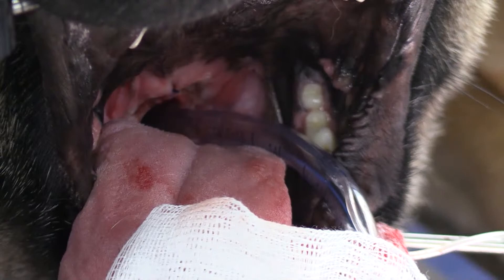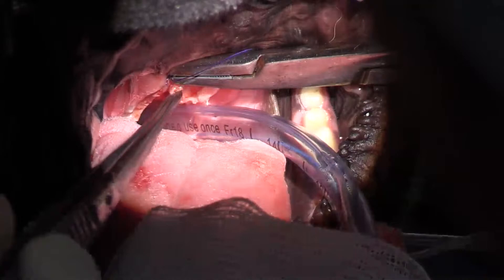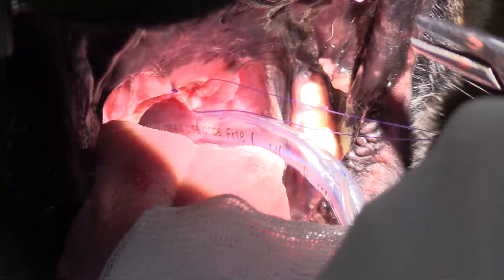It's about $2,500 Australian dollars for the machine, and then the wands are about $250 each. If you're using it for oral surgery, you can use them repeatedly. For those of you watching from outside Australia, the cost would be about $1,500 US dollars for the unit and then probably $150 for the wands.